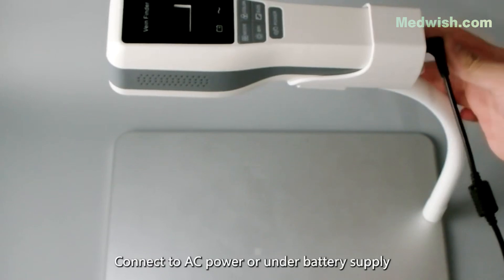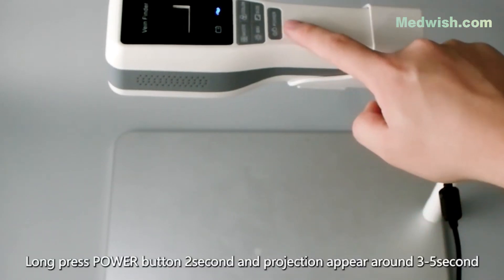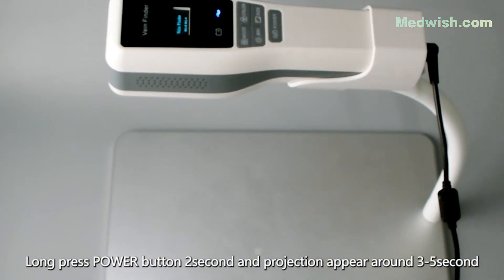Connect to AC power or under battery supply. Long press the power button for two seconds and the projection will appear around 3 to 5 seconds.